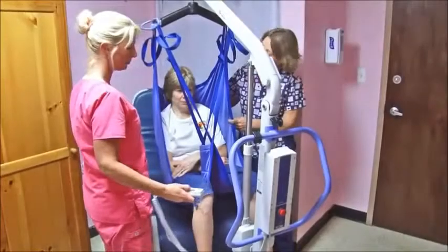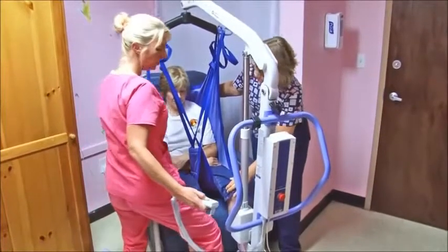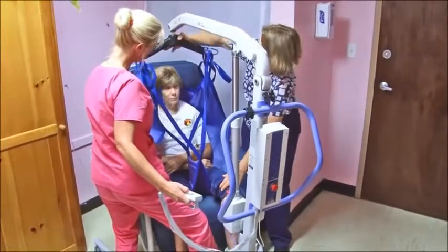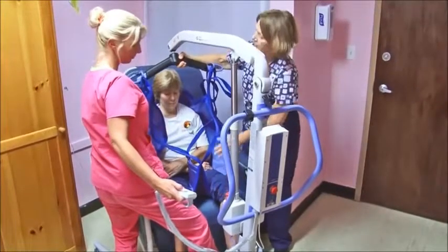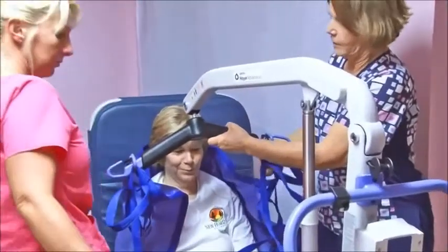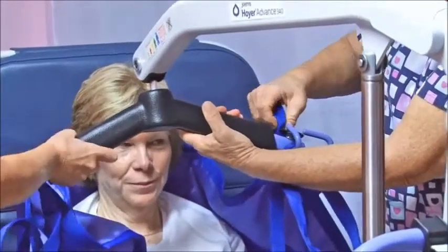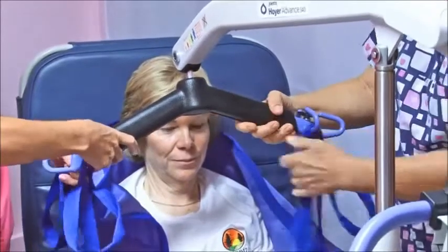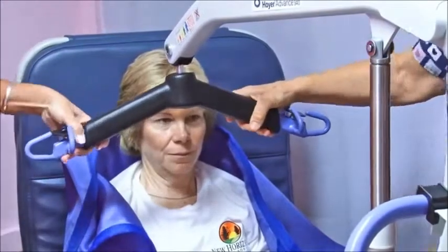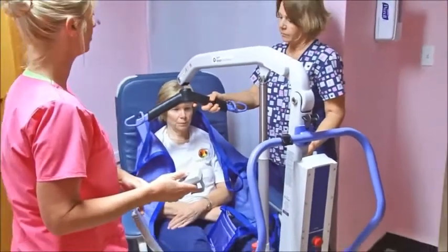We're going to lower you now into the Jerry chair. You can use your knee for support for the resident. And now we're watching here when we're lowering it to disconnect, and you can stop there, and then you can stop. You want to hold the bar while you're taking this off, or it's going to go into the person. Press down on the little tab as you're taking it off. And now it can be raised to be out of the way.